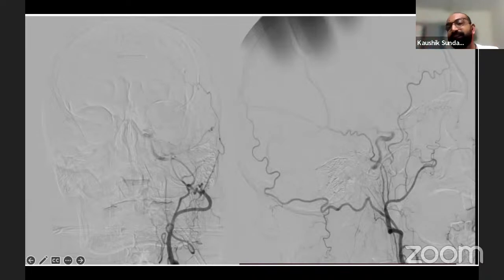This is a classical tandem lesion. You're getting what I'm saying? This is a classical tandem lesion because when you're taking a carotid shoot, beyond the ICA you cannot see. But in this case, the collaterals are showing you where those two lesions are. One distally at the MCA or distal ICA, and there is one at the proximal also, beyond which the collaterals are not. Now, this gives you an idea of how much thrombus load you are going to deal with.